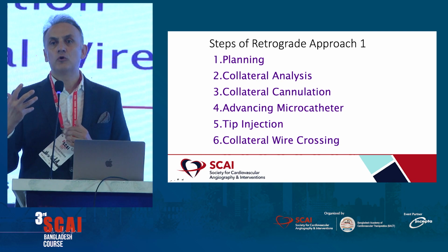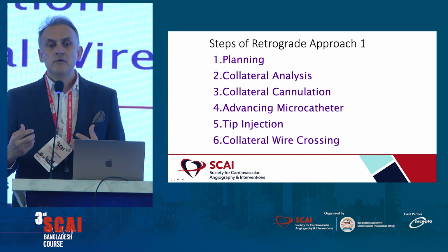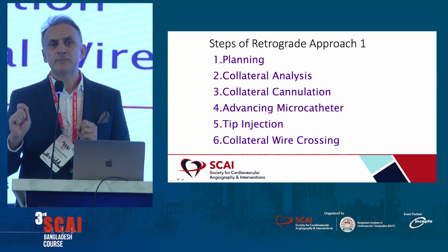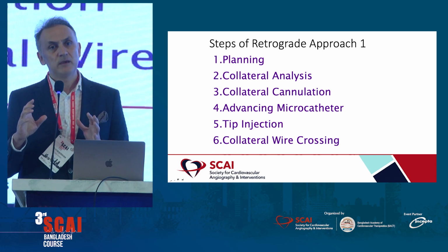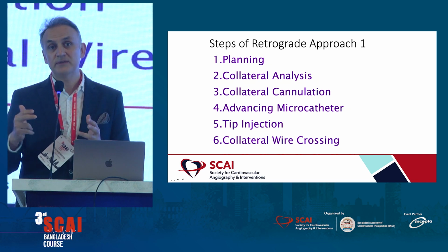We have to do collateral analysis before the operation, and then one of the important steps, I think, is collateral cannulation. Sometimes it's easy, but sometimes it could be difficult, especially for epicardial or some septals.